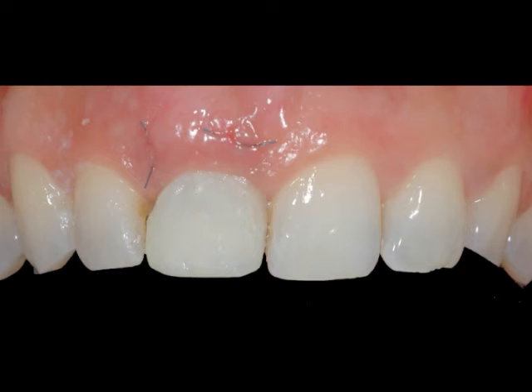Our first provisional is never that beautiful because it needs to be shorter on the incisal edge in order to protect our implant from shearing forces, and as I explained before, we like to have it short also in the interface with the gingival margin. All this makes our crown short and not beautiful.